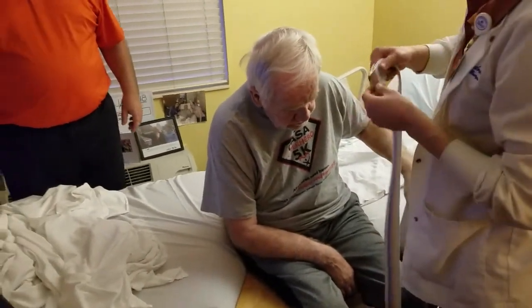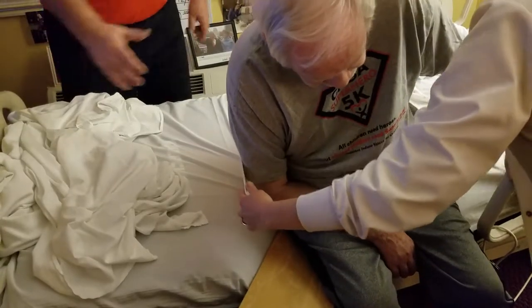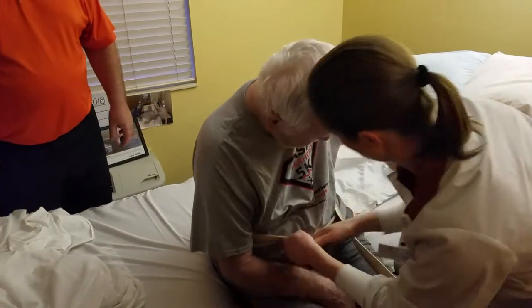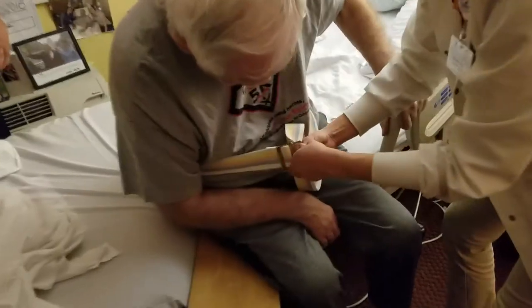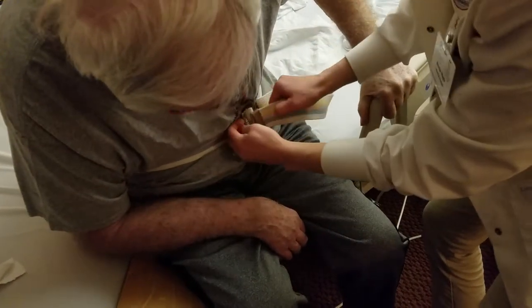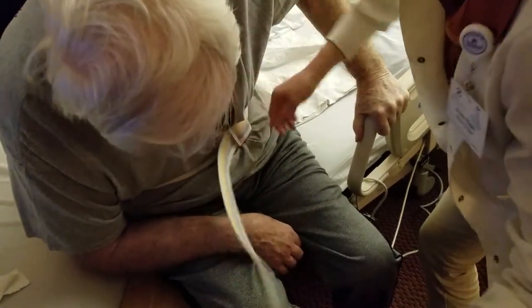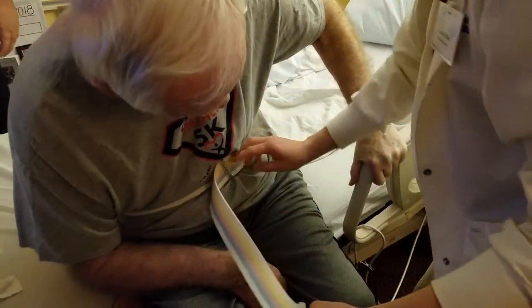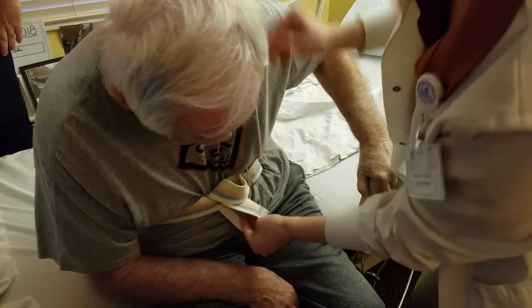Now put the belt on — the buckle part goes around him like this. It goes through the back first, through the teeth, pull it tight, and it should be through the teeth there, then go through that last buckle and it should be pretty snug. You should have room to keep your hands in there because you're going to need to grab hold of it, but otherwise it should not be loose — it should be tight. Just tuck the rest of it there to keep it out of the way.